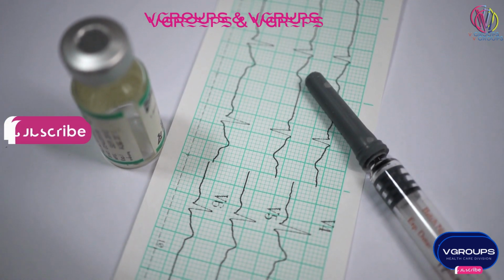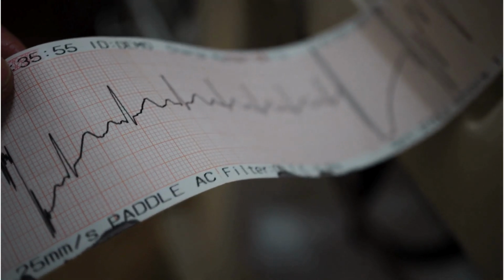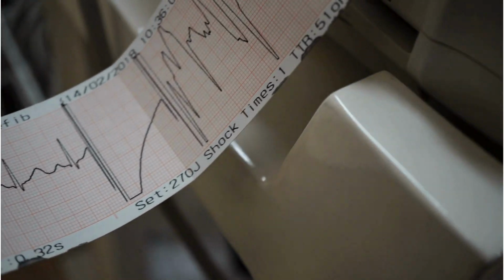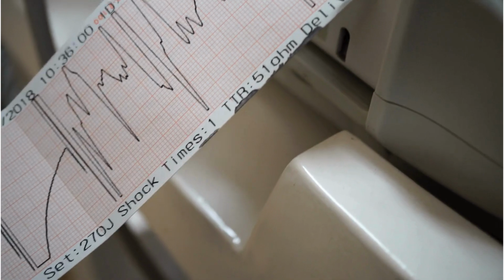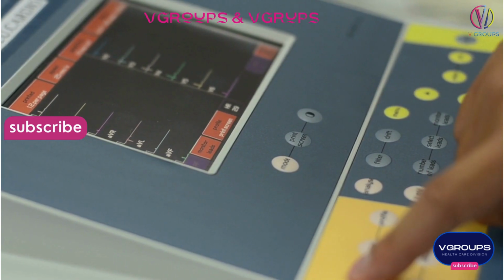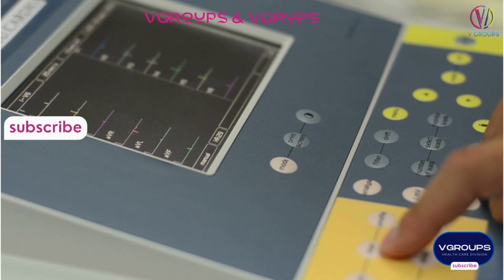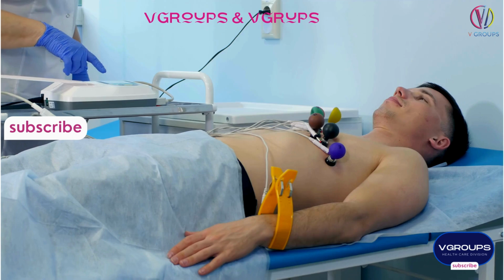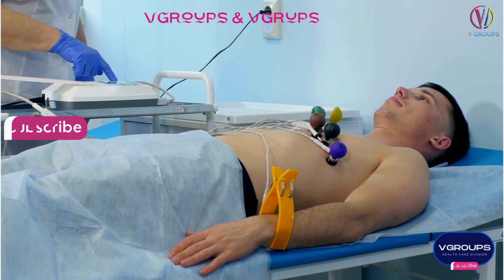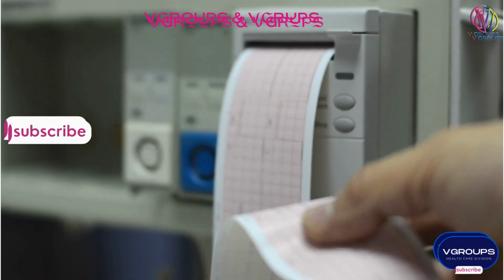Risk prediction in emergency situations. During emergency situations, such as chest pain or sudden cardiac events, an ECG is often performed quickly to assess the situation. Rapid identification of abnormalities allows for prompt treatment, potentially preventing cardiac arrest or other life-threatening events. Monitoring response to treatment. ECG is used to monitor the effectiveness of medications and interventions. Adjustments can be made based on ECG findings to optimize treatment and reduce the risk of adverse outcomes.